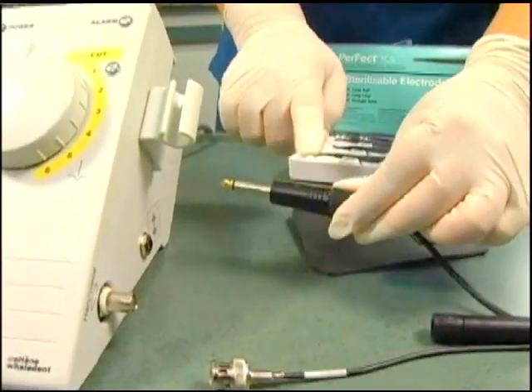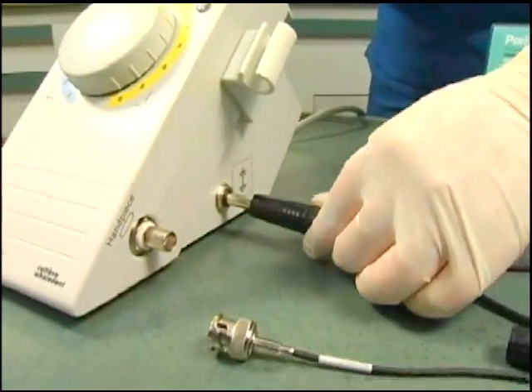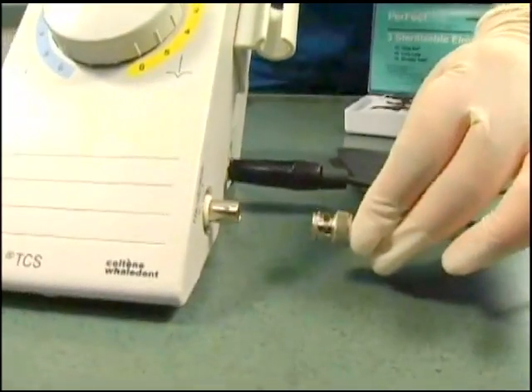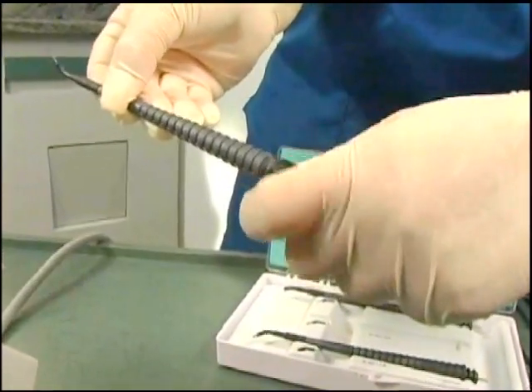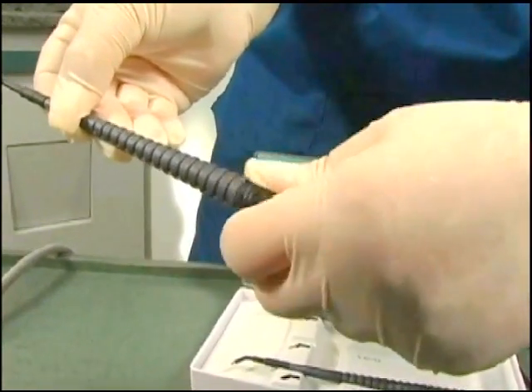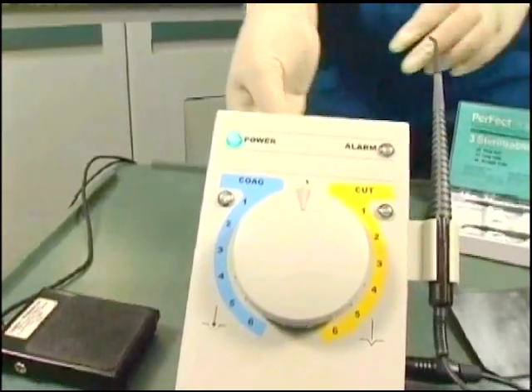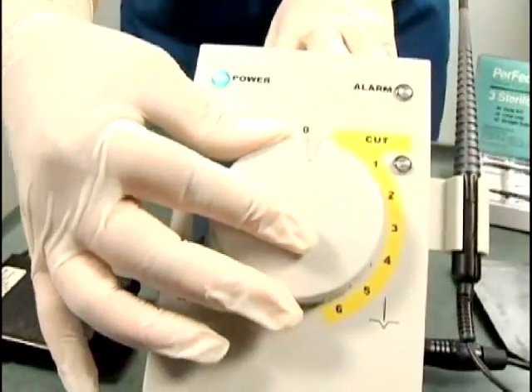As you can see, the control panel is laid out for easy operation. These are the jacks for the dispersal electrode and the hand piece. This is the on-off switch, and this rotating knob controls output power for either the cutting or the coagulation mode.